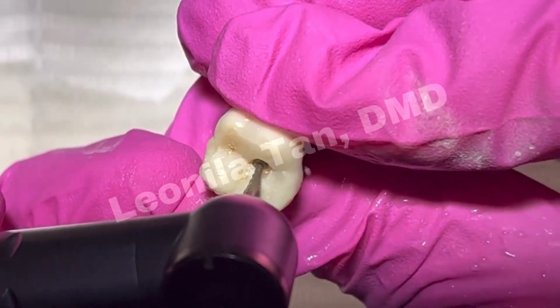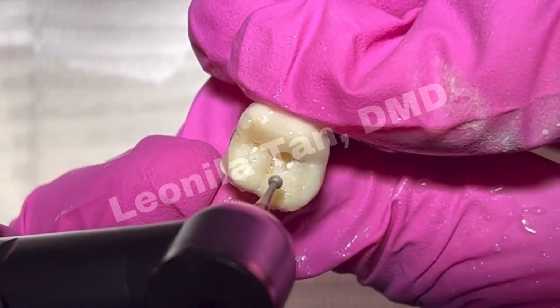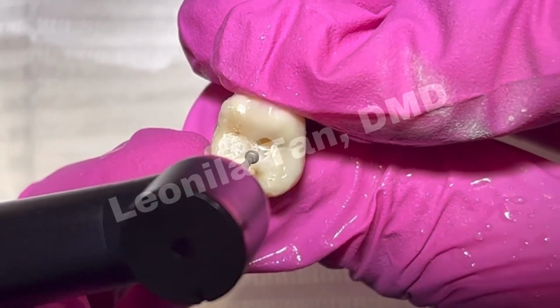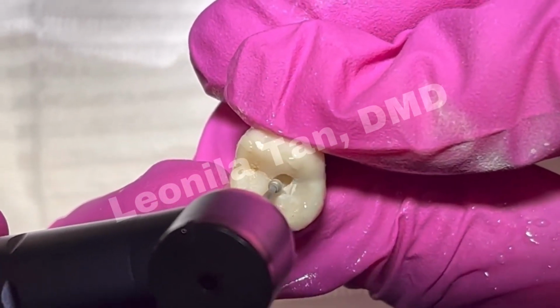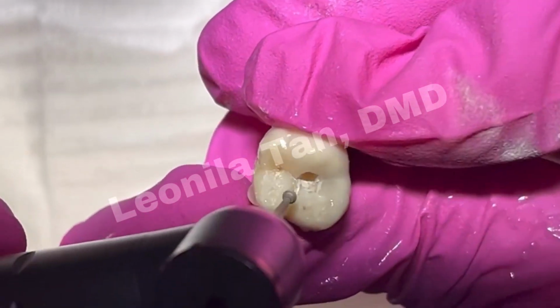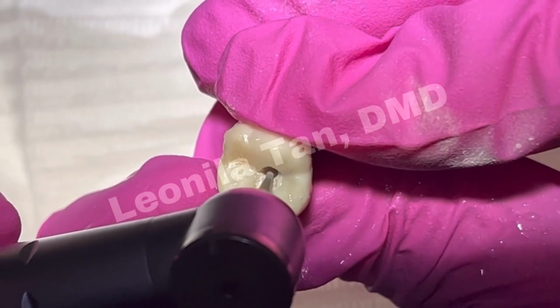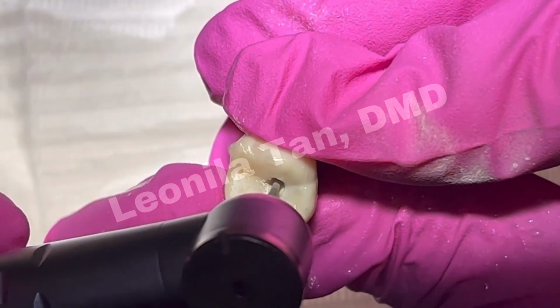So as always, before you start your access, you have to assess your radiograph, so you know if you are dealing with a big chamber or a large chamber or a very narrow one. So you do a touch and go motion.